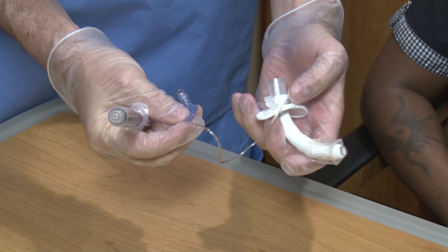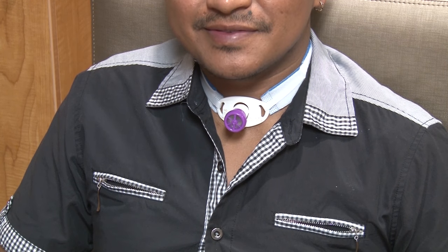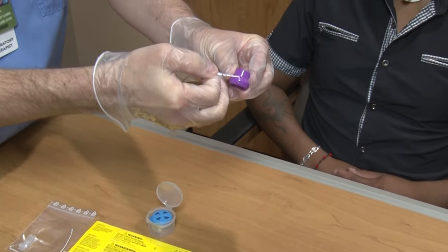Find the nurse, speech therapist, or respiratory therapist who can help. Once the speaking valve is in place, you should be able to talk. Once you become used to the speaking valve and you and your family have been trained, the speaking valve can be attached to the tracheostomy tube. The speech therapist will do this.